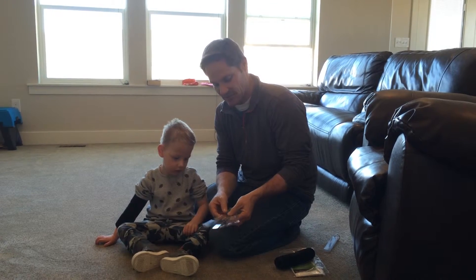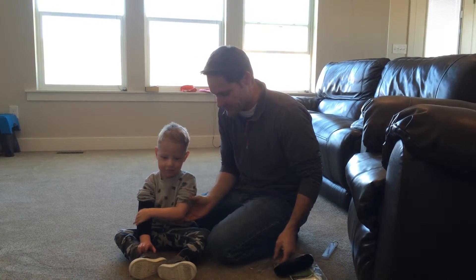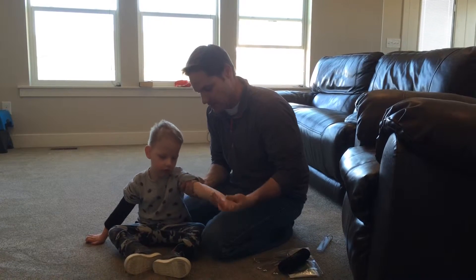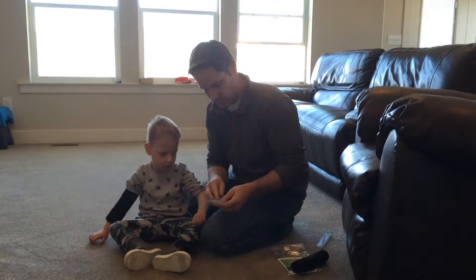We're going to take it from the stays that we have available. The one is most flexible and the five is most stiff. For Bronson, he doesn't have a lot of spasticity in there. If he were holding up, I might use a stiffer stay, but he's got pretty good control. So we're going to use the number two.